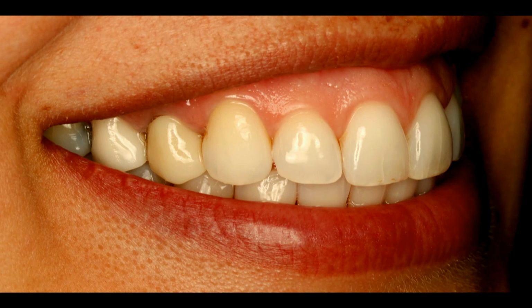So, of course, we're always trying to be minimally invasive. John's case clearly was in the aesthetic zone. A lot of times we're taking out premolar teeth, which are also in the aesthetic zone, which is very key.